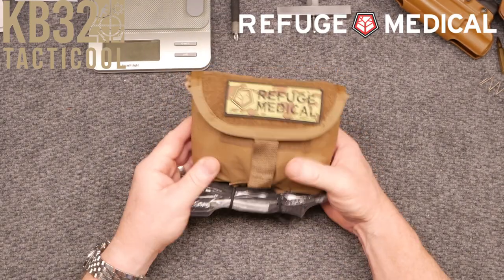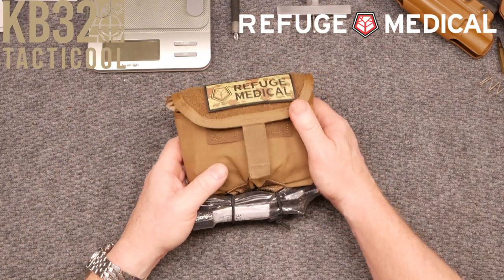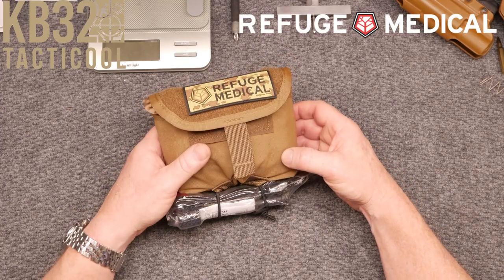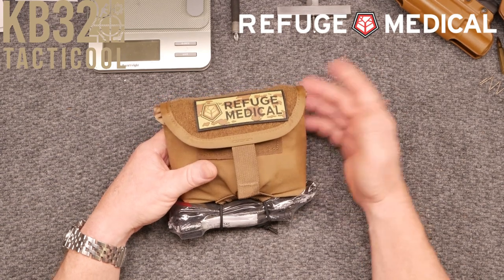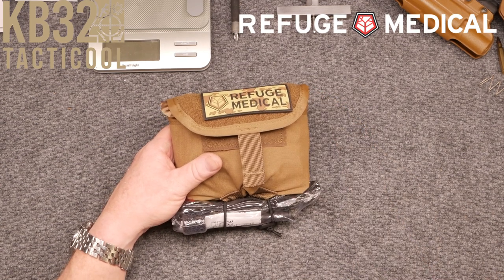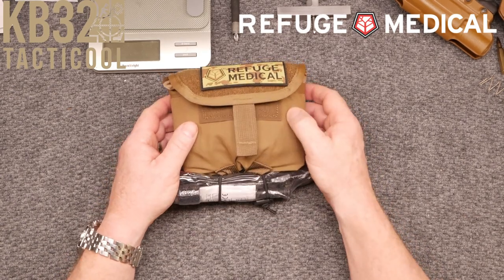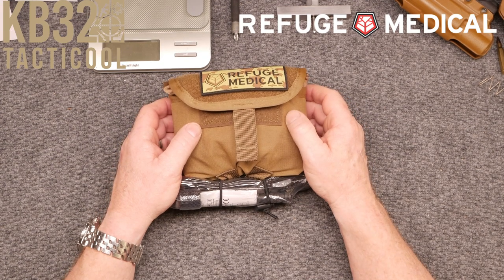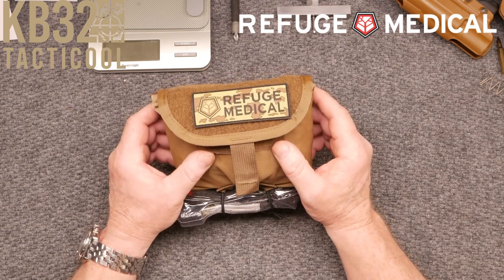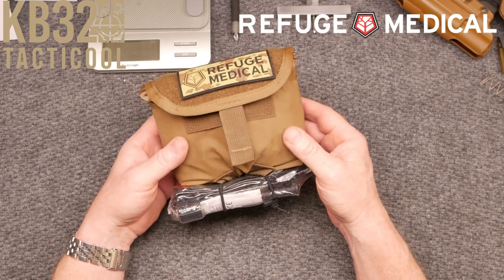You can also open it up and yank it out. Each SOB kit is hand built and made in the USA. The SOB kit — that stands for small of the back — is a purpose-built individual first aid kit, thoughtfully designed to address the MARCH-E algorithm when treating life-threatening bleeding, airway, and respiratory issues, and more.